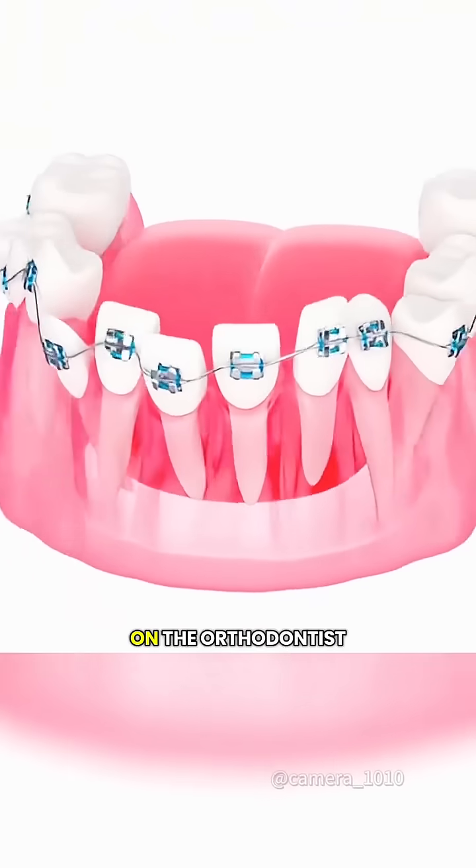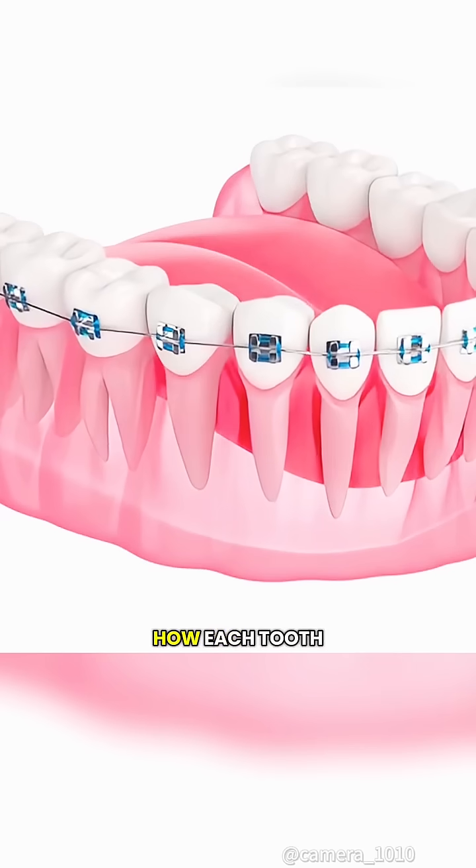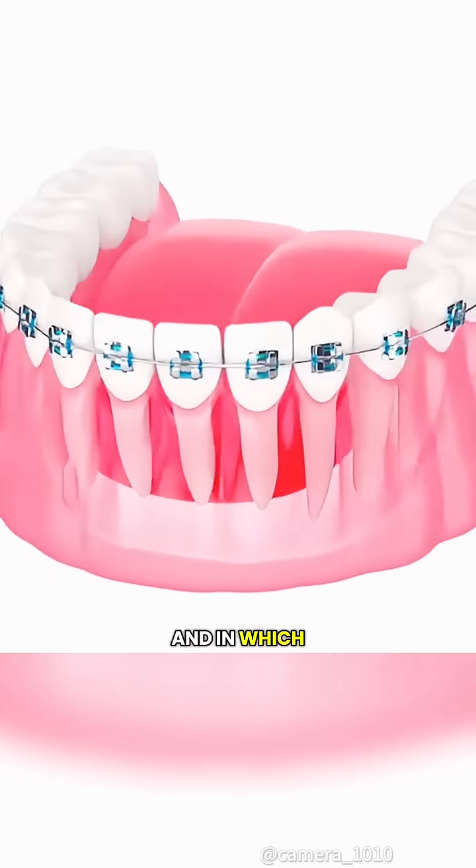As treatment goes on, the orthodontist regularly adjusts the tension in the wire to control exactly how each tooth moves and in which direction.